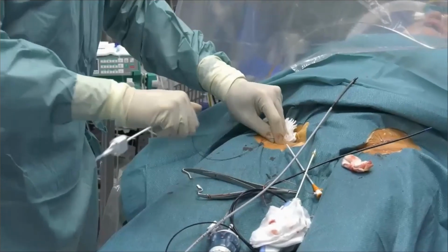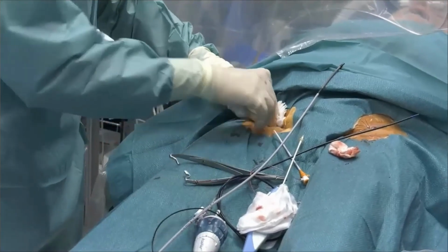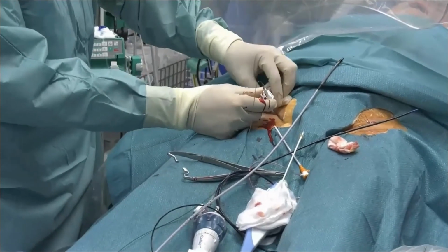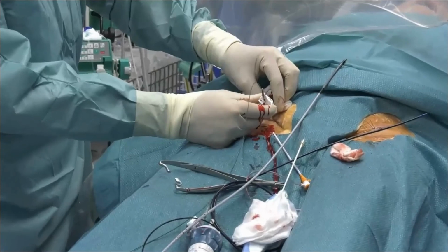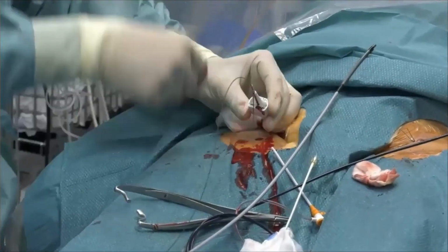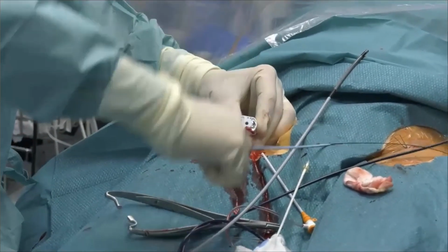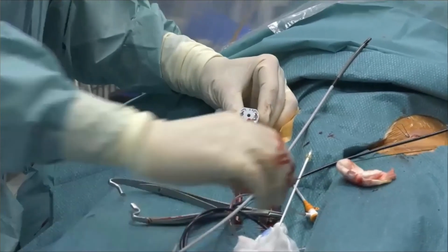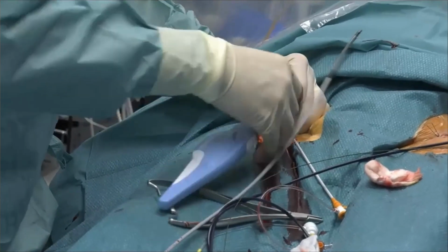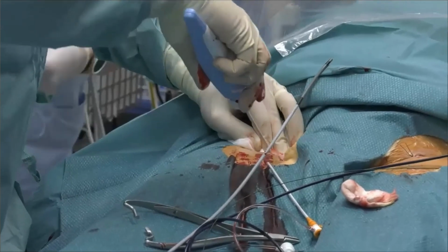Locate the artery: insert the Angio-Seal locator and the sheath over the wire until blood flows out of a small drip hole in the system, then withdraw and re-insert to confirm correct location in the vessel. Then set the anchor: insert the Angio-Seal device, click into place and click back to deploy and set the anchor. And finally, set the seal and pull back the device assembly until the suture stops, like this.